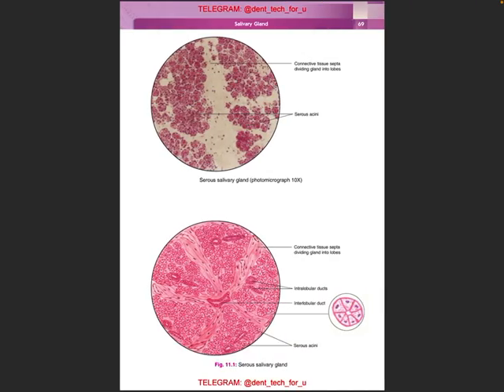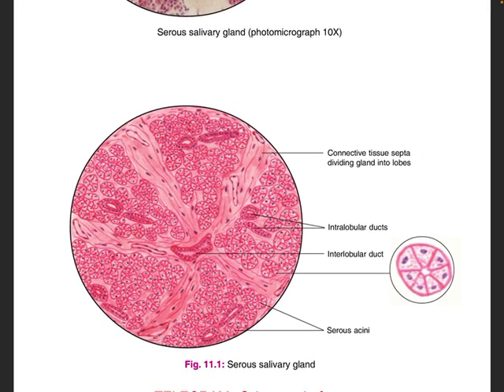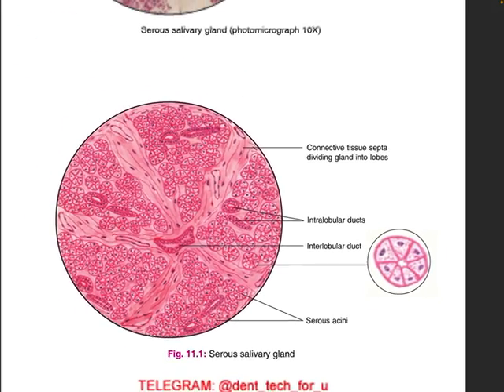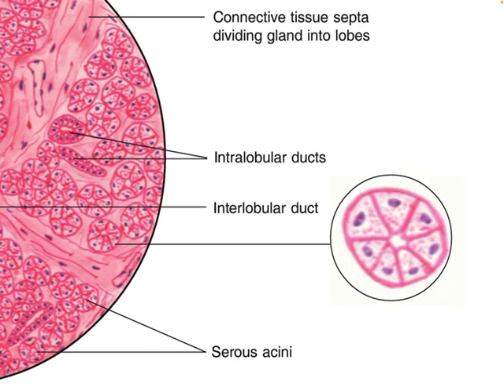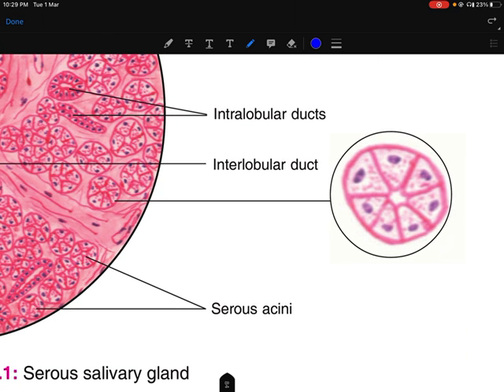Yeah, so today's session I'm going to learn to identify the salivary glands and the cells. So this is the... oops, yeah.